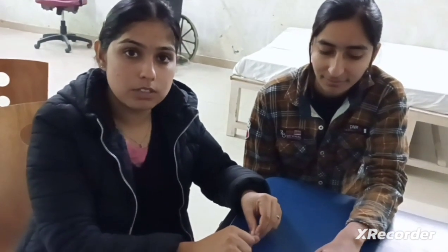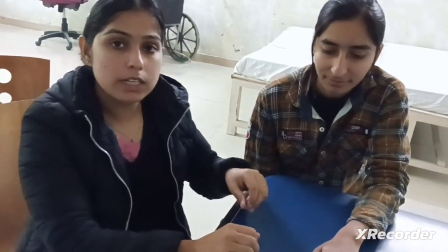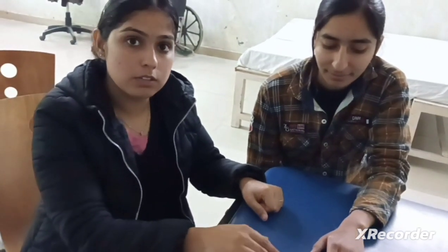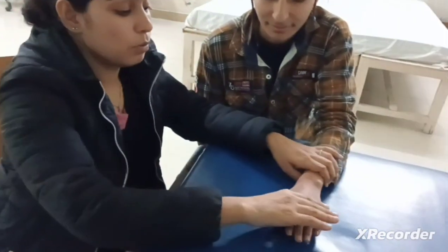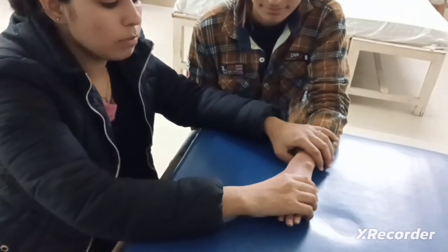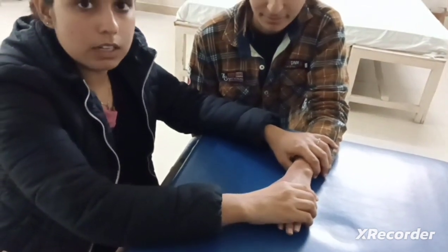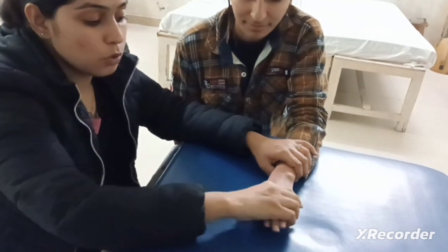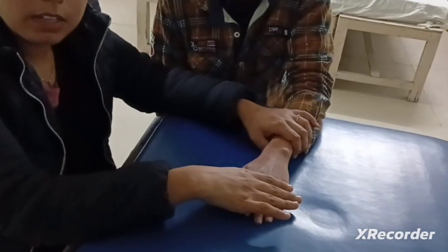So in this video, I will show you the goniometry of the wrist radial deviation and wrist ulnar deviation. So first I will show you the wrist ulnar deviation goniometry. Before checking the wrist ulnar deviation goniometry, we will check the wrist range of motion. For passive range of motion, stabilize the forearm and do the wrist ulnar deviation. So this is the passive range of motion of the wrist ulnar deviation.